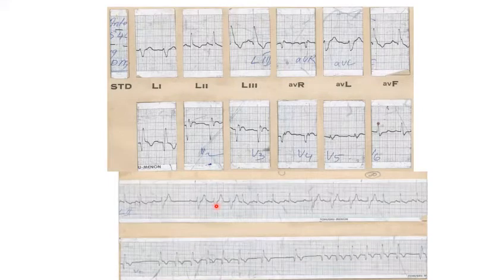How do you diagnose trifascicular block? To diagnose trifascicular block, there should be evidence that the right bundle is involved, the left posterior fascicle is involved, and the left anterior fascicle is involved. Then only can we diagnose trifascicular block. The problem of trifascicular block is that these are candidates who are prone to develop complete heart block and may require permanent pacemaker implantation. Okay, right. Any doubts? Okay, we'll go to the next one.